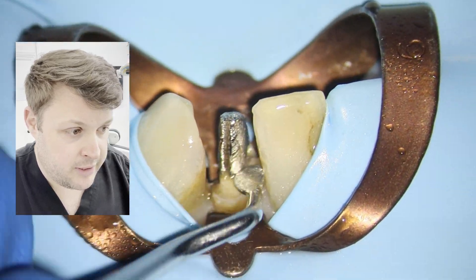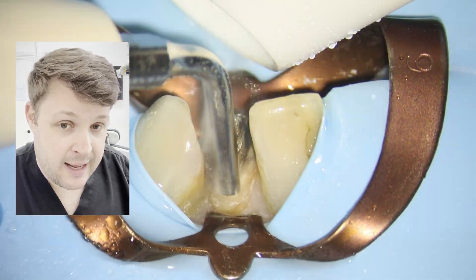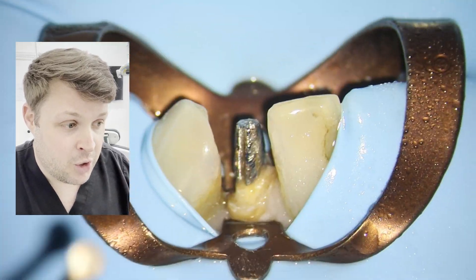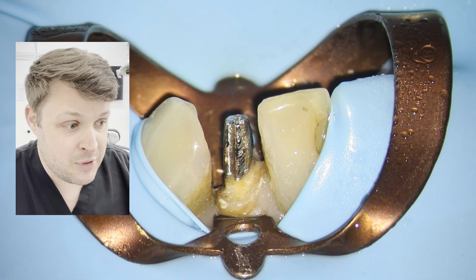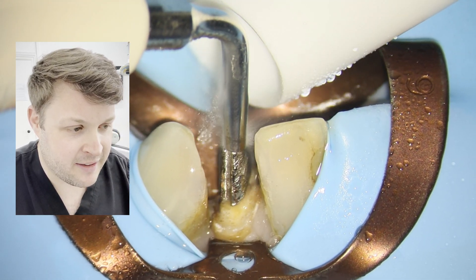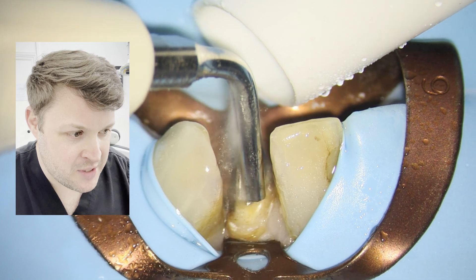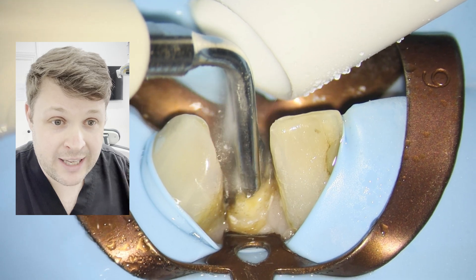It's really repetitive — you've got to take your time with it. I've been taught that using two ultrasonic tips at the same time is really beneficial, but in our case I didn't have that. So I'm using the one tip, and then I see there's a bit of movement — I think the game's on. I can just ever so slightly see a little bit of movement in the post, and when I see that I know we're getting somewhere.